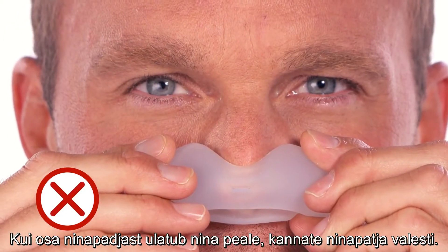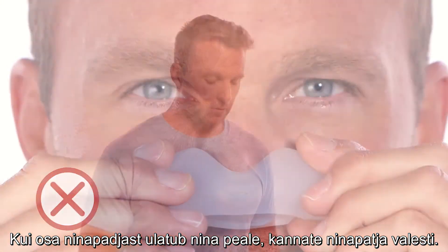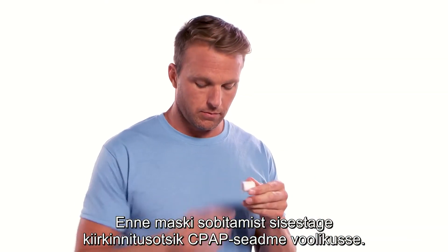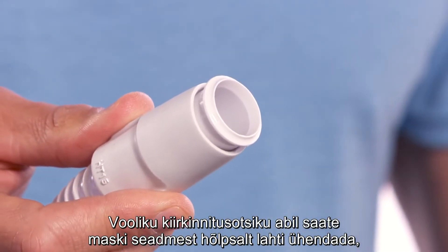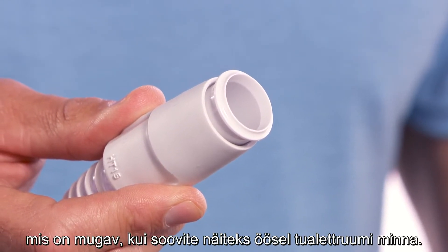If part of the cushion overlaps your nose, the cushion is being worn incorrectly. Before fitting the mask, insert the tubing quick release into the tubing that came with the CPAP device. Notice that the tubing quick release lets you easily disengage from the device, which is convenient when you get up to use the bathroom at night.